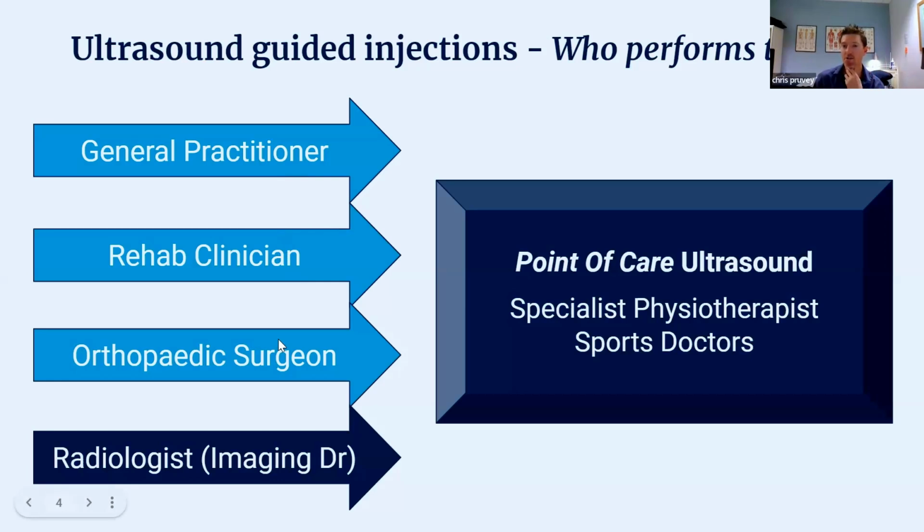I struggled earlier to get an image online quickly, so I went into my scanning machine and used one of mine. It's just a musculoskeletal ultrasound image on the software I was using. Traditionally it's been used for more organs and soft tissue, abdomens and so on, which it's been very useful for. But the resolution of the images with the ultrasound machine has now improved to such an extent that we're now seeing more and more use of it within musculoskeletal and orthopedic disorders, and that's really why.